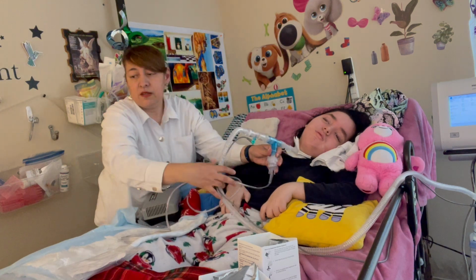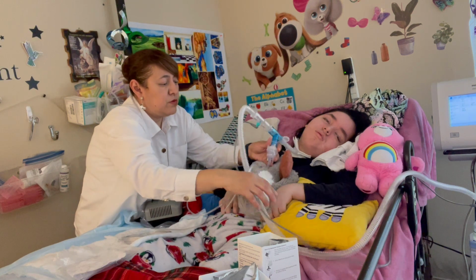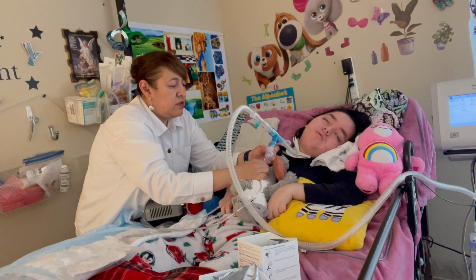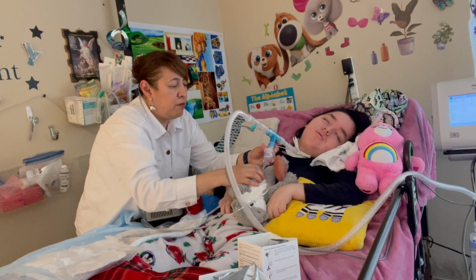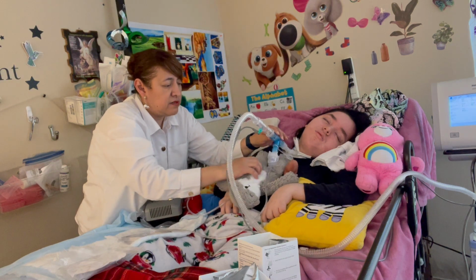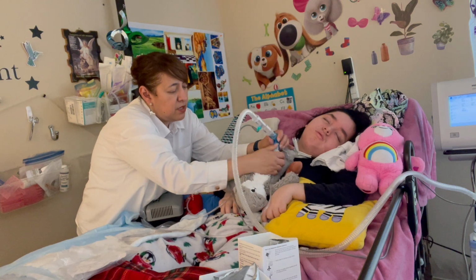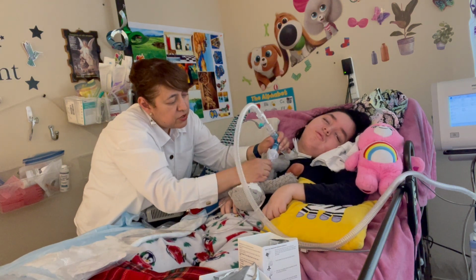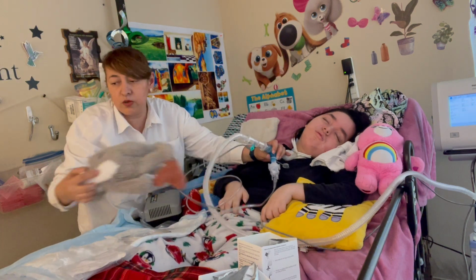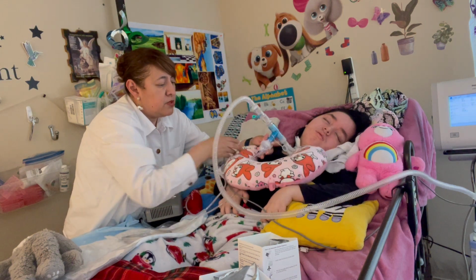And here, I put something here just so the liquid won't fall or bend. So you just have to make sure everything is tight correctly here. Usually this helps me, sometimes it doesn't. See, the medication starts falling, so you just have to make sure. So this one really doesn't work, so I have to put a pillow. Sometimes a pillow helps here.